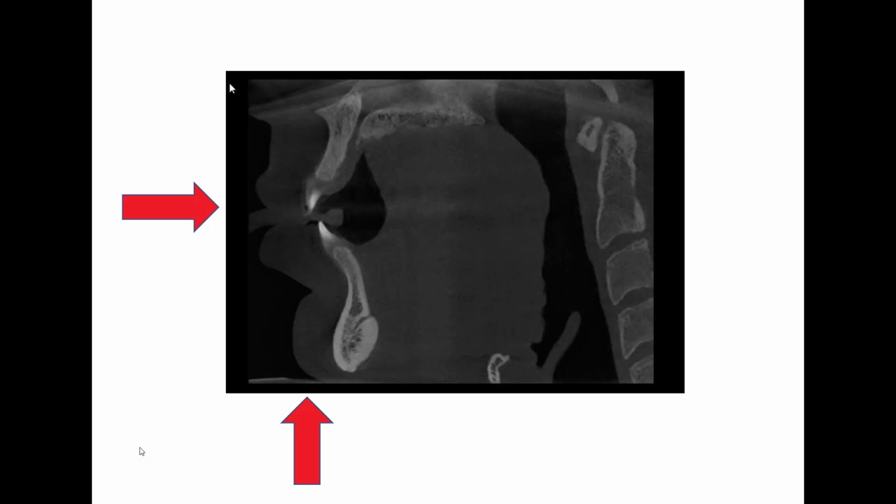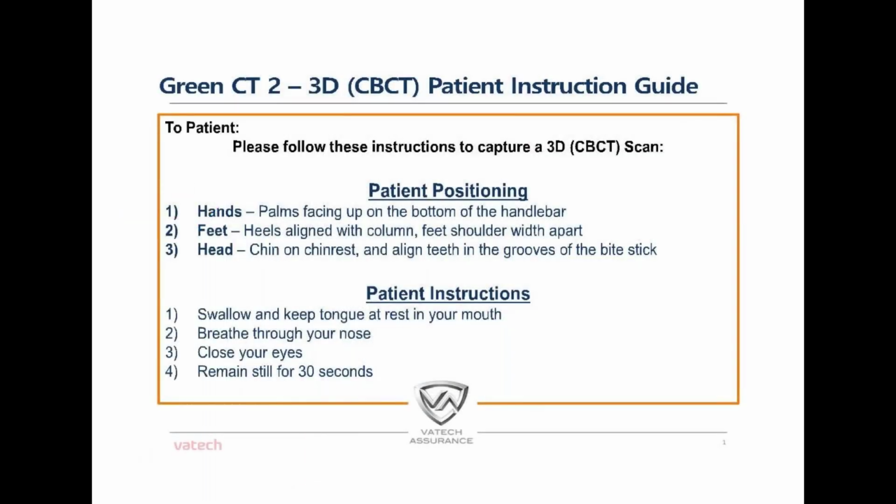And speaking of another tip, we have some talking points coming up, on how we're going to talk to the patient to let them know what's happening. And Paul, you had mentioned a lot of these a couple of slides ago, but this really goes into progression. This is another slide that can be downloaded from our website. It's really hands palm facing up to lower those shoulders and relax the patient.